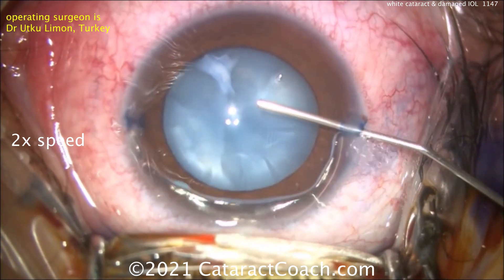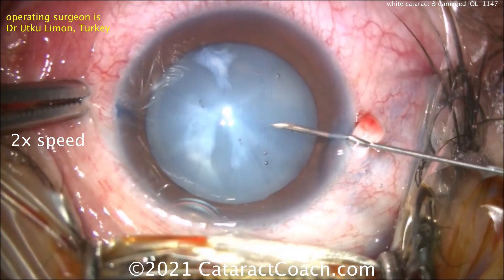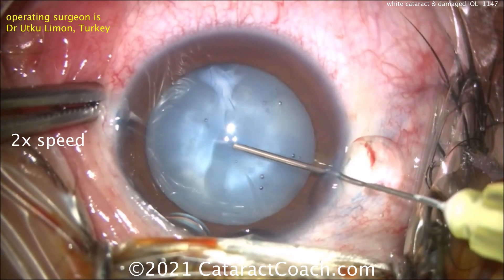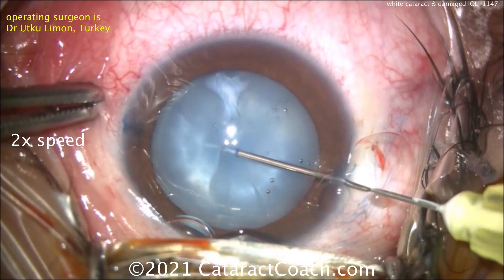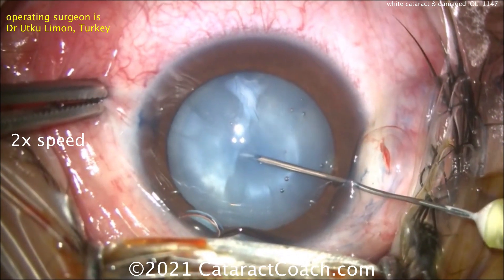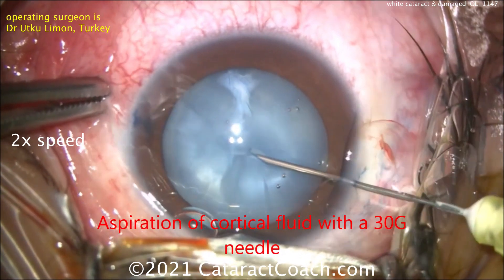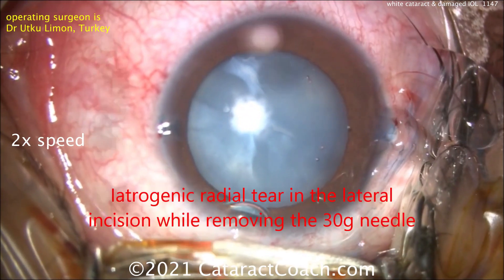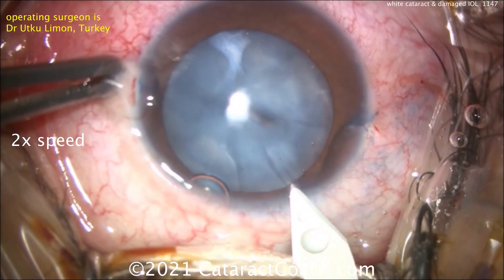We've sped the video up to two times speed so I can show you the whole case. Here is the needle decompression to get out some of that intumescent fluid. As soon as you poke in, you can see how elastic that capsule is — aspirate, aspirate, aspirate, decompress that bag. Rock the nucleus a little bit, decompress, and get more fluid out of there. That's a very important technique. You can use a 30-gauge needle; I sometimes use a 27-gauge needle and that works pretty well.